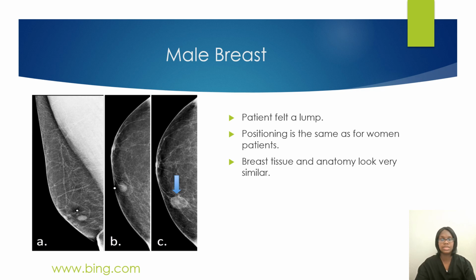The case study for this male patient is that he felt a lump, and whenever you position and take this mammogram, it's the same as when you're positioning a woman for her mammogram. So it's the same way. The tissue is going to look very similar, like the anatomy.